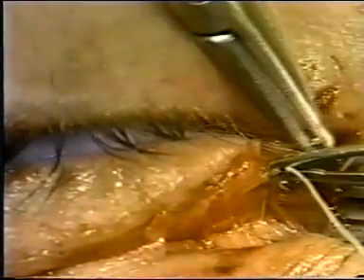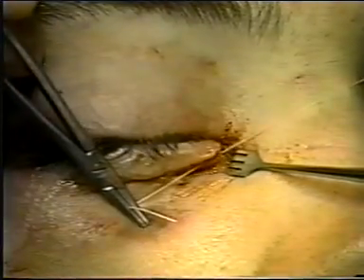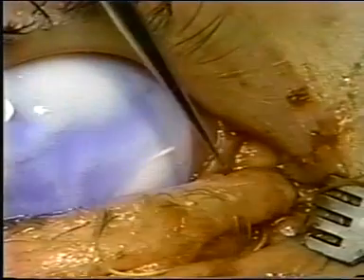Several vicryl sutures on a P2 needle are passed through the medial canthal tendon area to reattach the cut end of the lid. We try to place one above the cut canaliculus and one below. The position of the plug is checked to make certain that it is within the lacrimal lake.